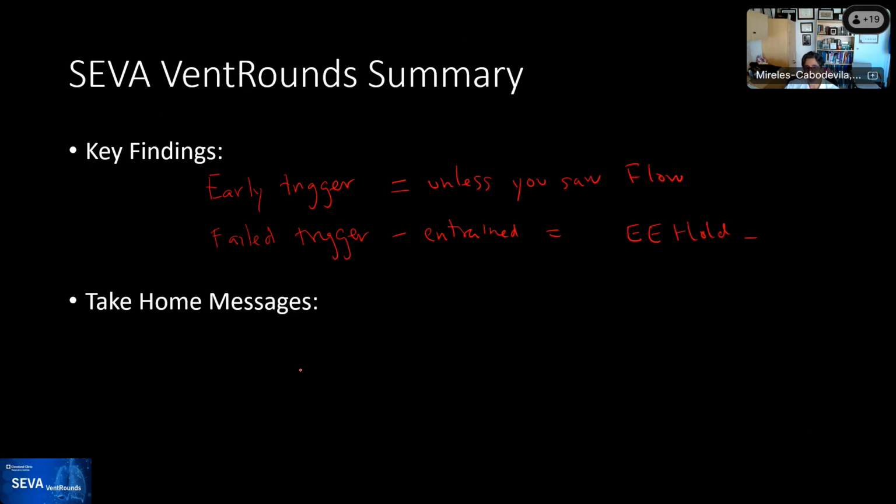So I hope that this brings to you a couple of key messages about knowing where to look. So look at flow when you're controlling pressure, and look at pressure when you're controlling flow, and always do your 2 pauses. 2 pauses leads to happiness.